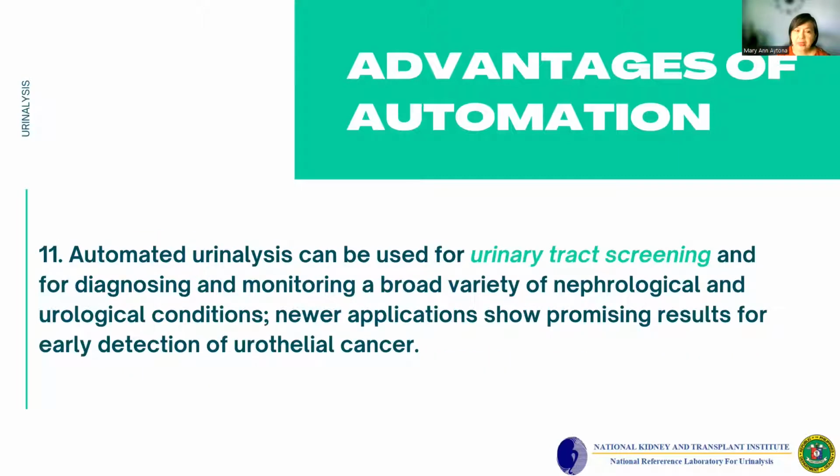And automated urinalysis can be used for urinary tract screening and for diagnosing and monitoring a broad variety of nephrological and urological conditions. And newer applications show promising results for early detection of urothelial cancer.